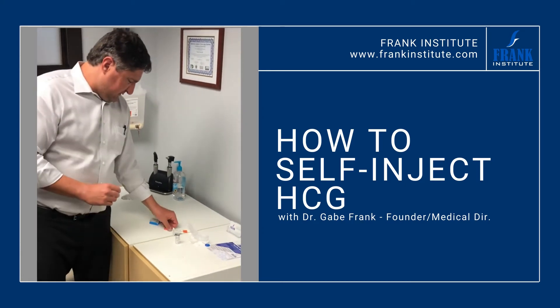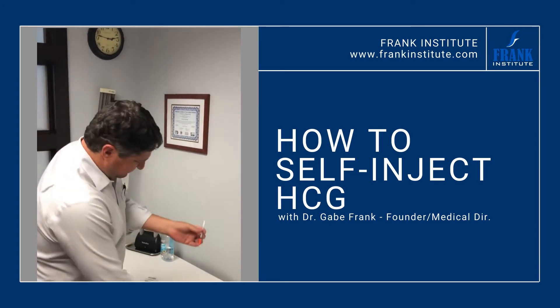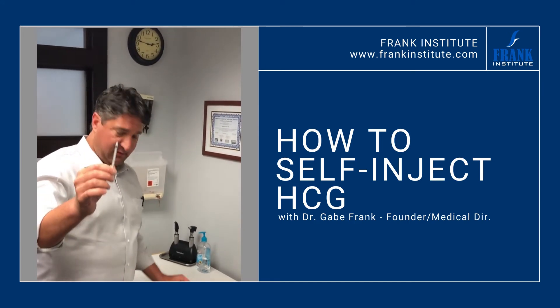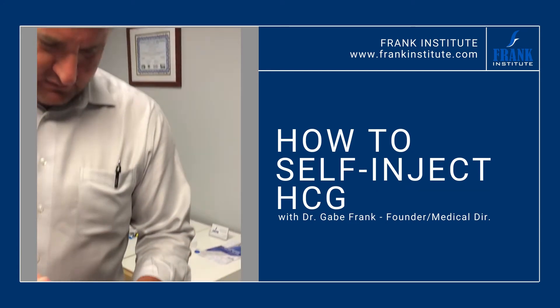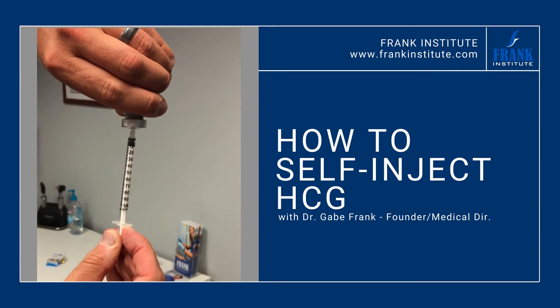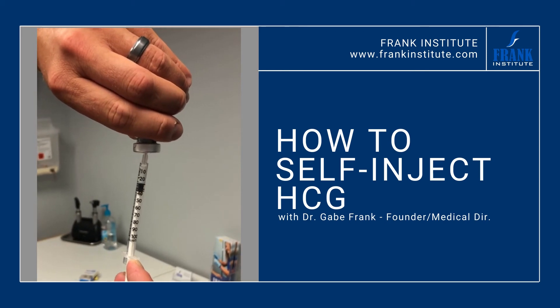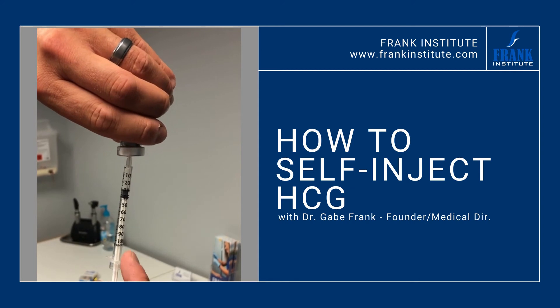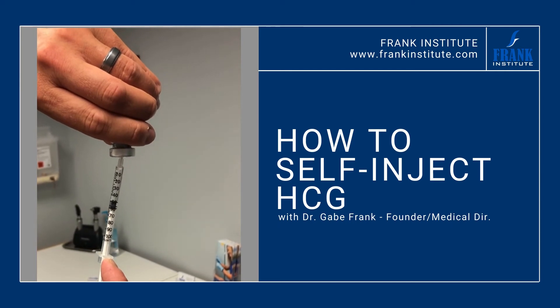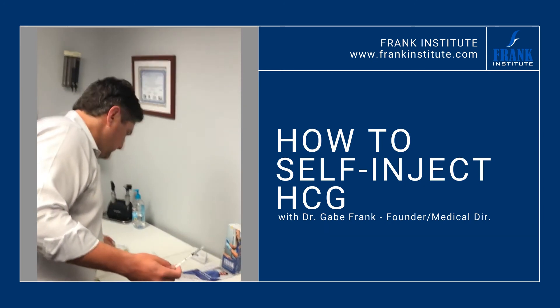Now what you're going to get is the insulin-style needle. These are one cc insulin needles. Go ahead and pop off that part, pop off that part. This is a tiny, tiny, tiny needle, so you have to be careful when you put it into the bottle. Go ahead, right in the top. You're going to fill it to the 50 — 5-0. Nice and slow. If you get a little bubble like that at the top, just go ahead and push up. A little bit of air is not going to kill you. Top of the plunger right at the 50 line.